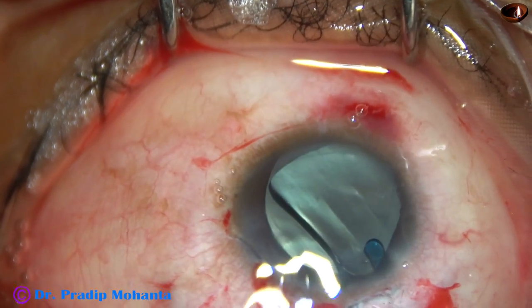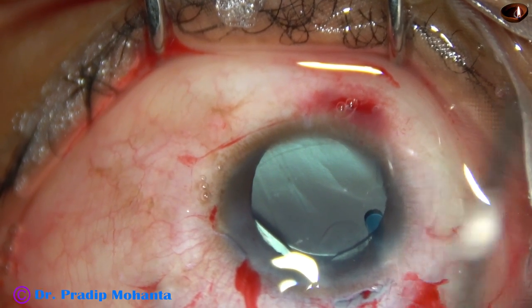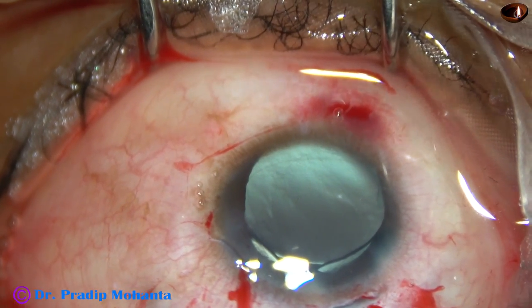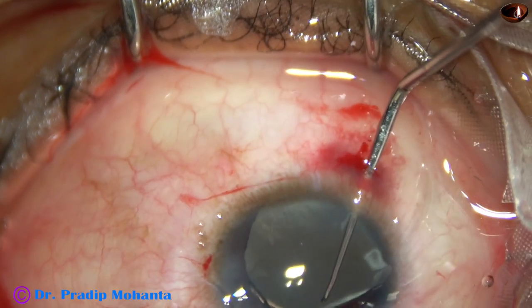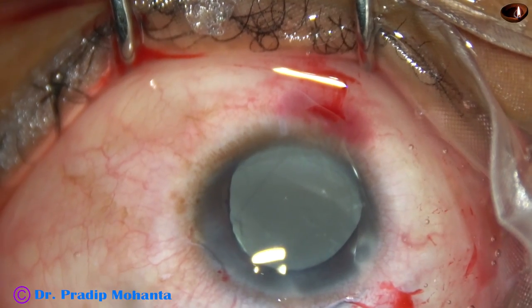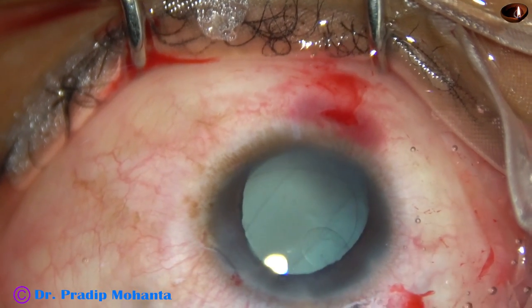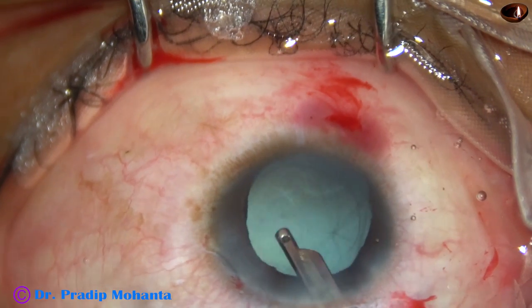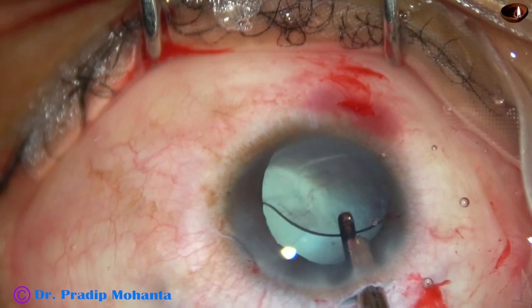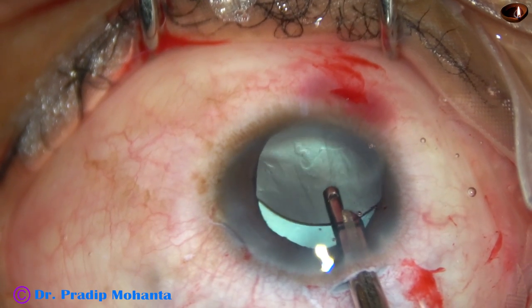This is a hydrophobic acrylic single-piece monofocal intraocular lens. The leading haptic has gone into the capsular bag. Now I inject some visco, then introduce a Sinsky hook through the 7 o'clock incision and place the superior haptic in the capsular bag. The lens is nicely placed in the capsular bag, and now I am going to remove the visco. I irrigate some BSS in the anterior chamber and then go behind the IOL and irrigate the capsular bag.